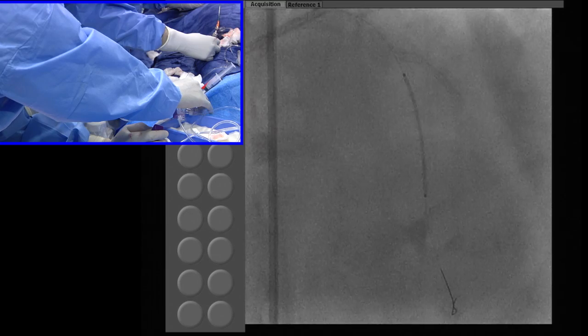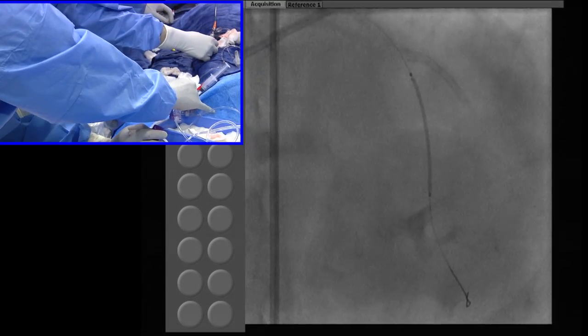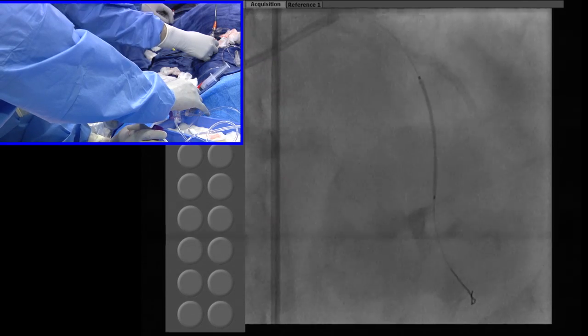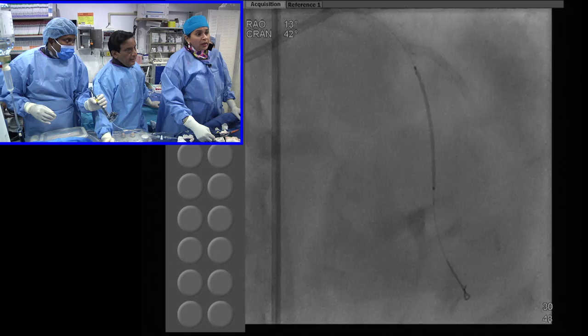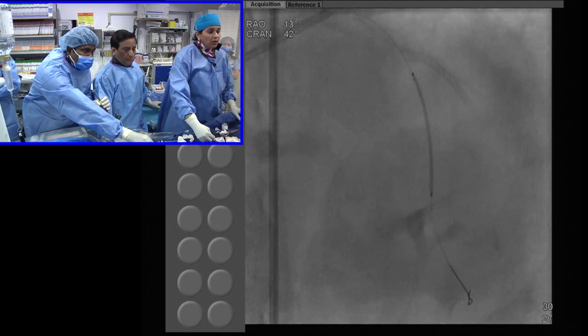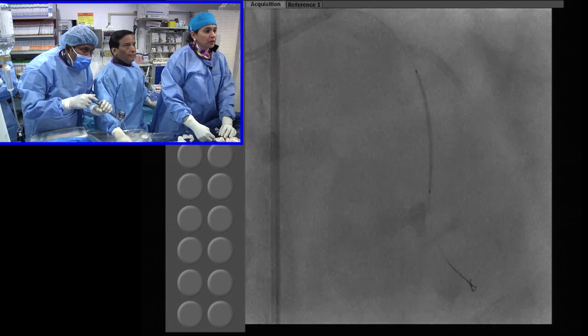Ideally, how much overlap do you want here? Probably none, which is going to be very difficult, because the stent on the Promus is inside the stent material. Ready? Go. We will have maybe a millimeter overlap here now. Go up.